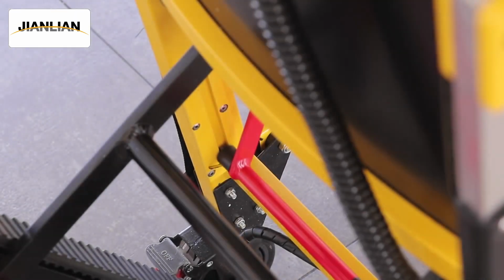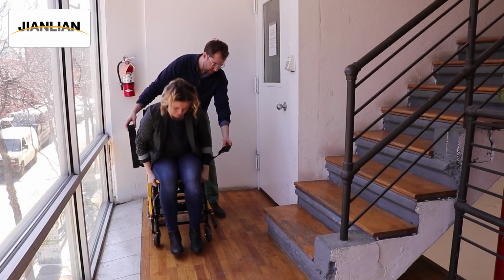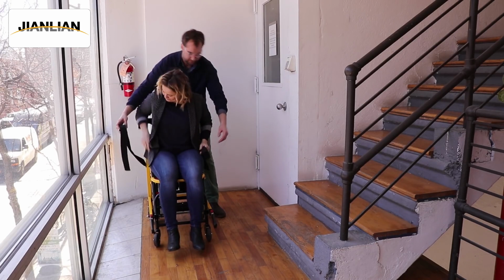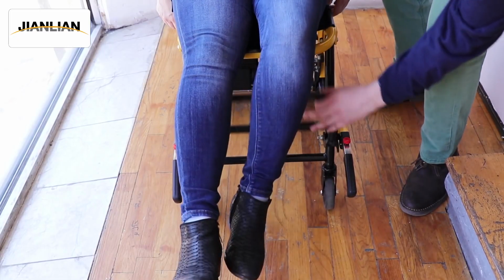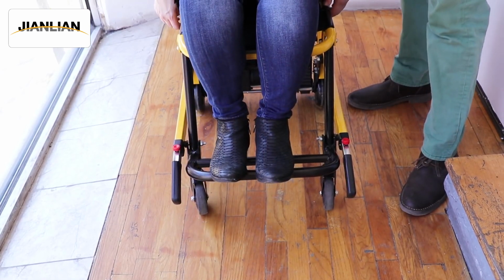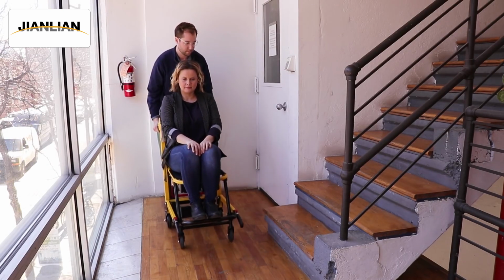Before the rider sits down in the seat, make sure that the stairlift is completely unfolded and that the rear wheels are locked. Once the rider is seated, and before unlocking the wheels, make sure that they are strapped in with the safety belt and that their feet are resting on the footrest. The rider must always be secured by the safety belt when the chair is in motion.